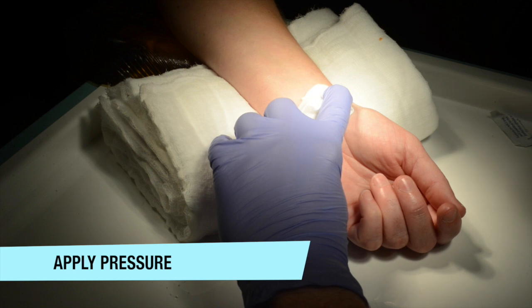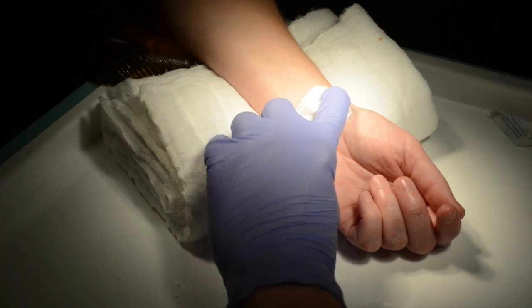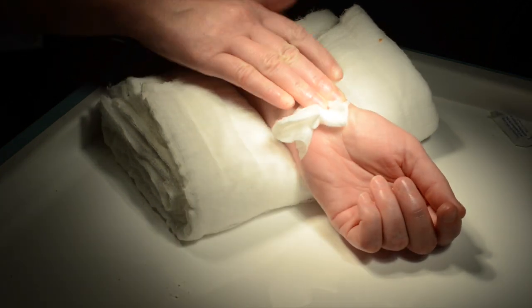Once you have removed the needle, ensure that you apply pressure to the arterial puncture site for anything up to 5 minutes.